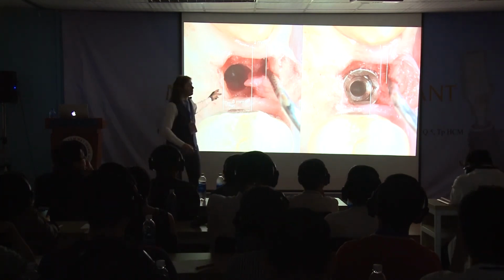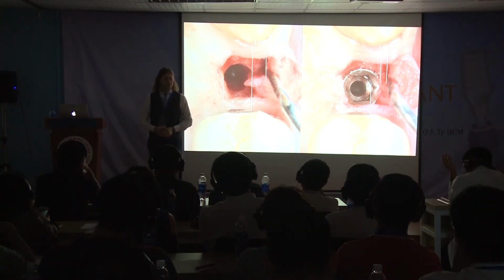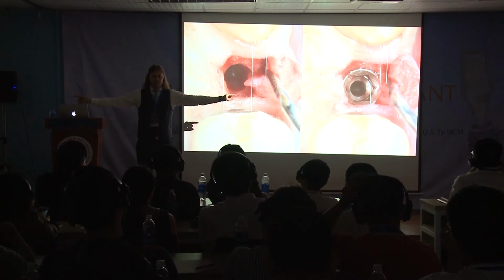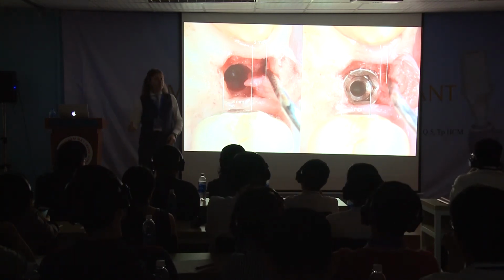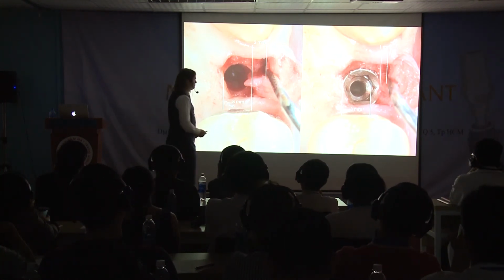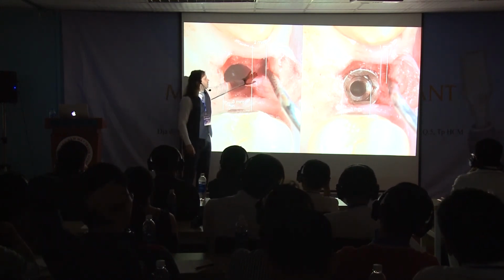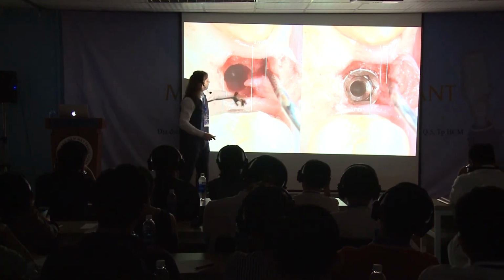There is a gradient of density of the bone. That's why fistula goes out. Imagine the problem if the fistula goes inside the brain. No good. So this is soft, and the self-tapping will destroy this part, destroy it.